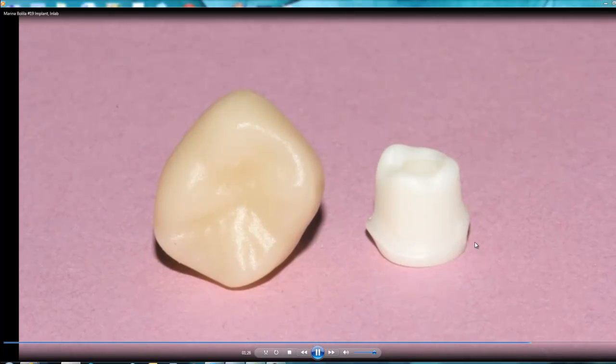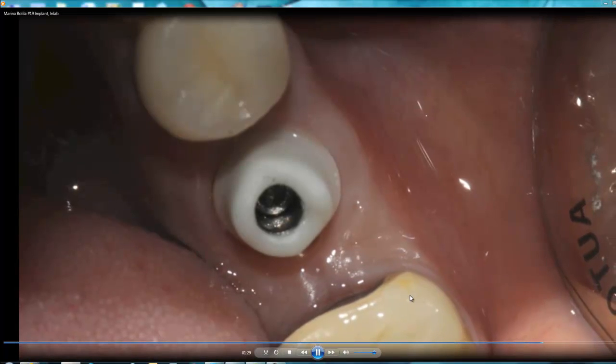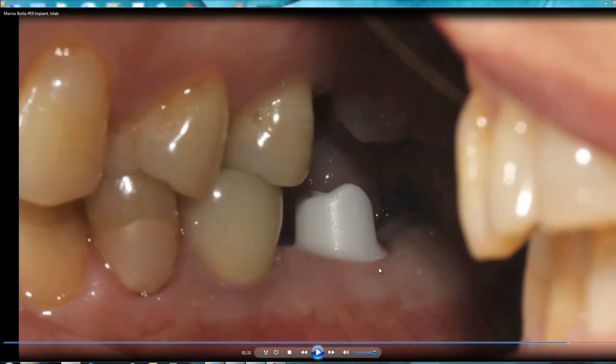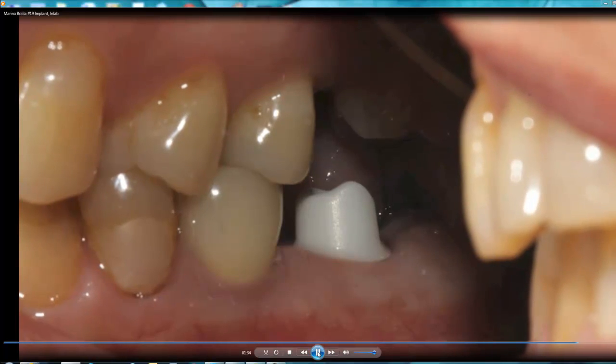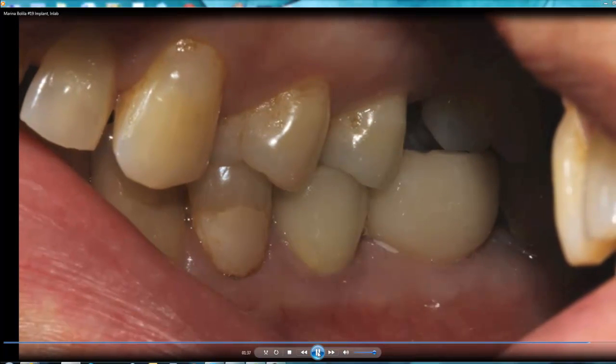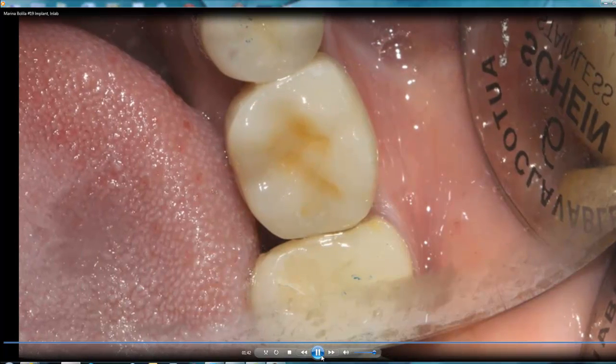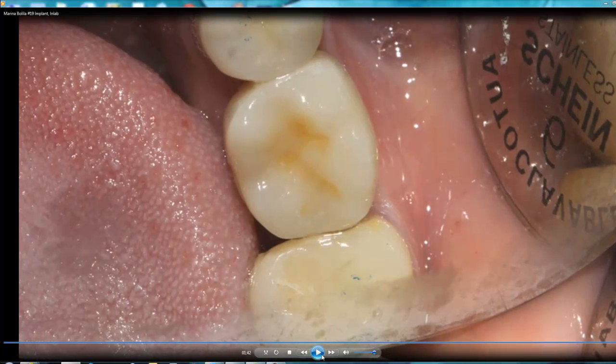That's the final result. You can complete this case within a day if you have everything in your office. The restoration fits according to the tooth structure — no pressure, everything looks nice, 0.5 mm below the gum level, with nice occlusal clearance between upper and lower arch. We cemented the crown with Premier implant cement. You can see a little residue of cement, but notice how the tissue healed perfectly. Patient is satisfied, I'm satisfied with the result — and that's what you can do in your office. Thank you very much.